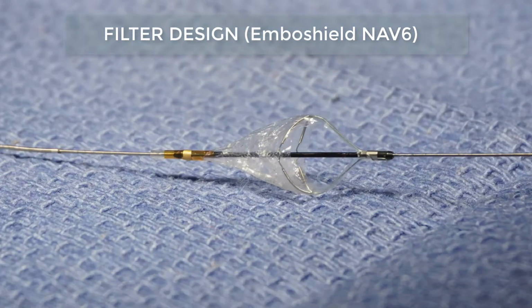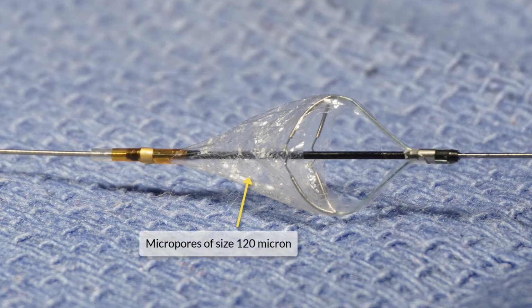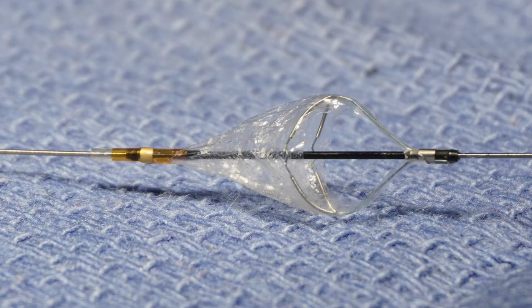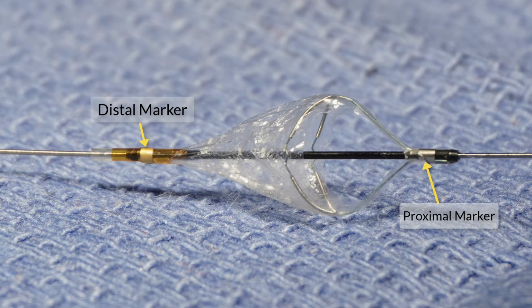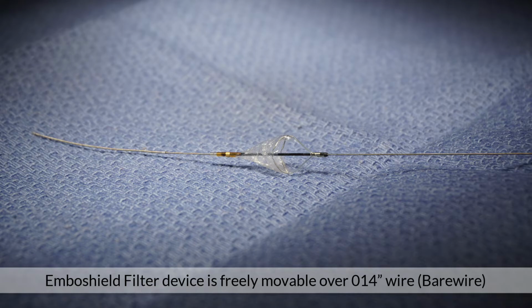Emboshield filter device has an umbrella-like nylon membrane and nitinol frame. This nylon membrane has multiple micropores to allow blood perfusion and to trap the embolic material. It has 2 radio-opaque markers at the proximal and the distal end. Emboshield filter device is a monorail system preloaded on 0.014 wire. Emboshield is not fixed on this wire.